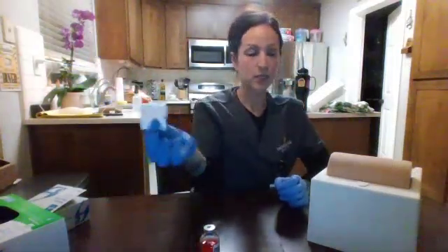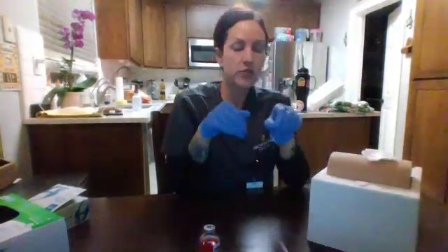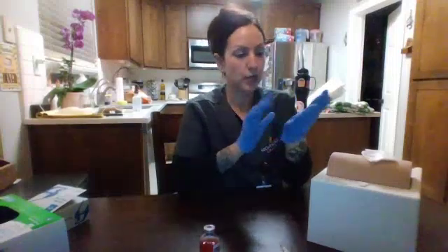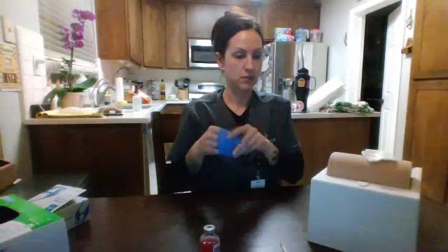I'm going to place a gauze pad over the injection site. I'm not going to press or massage on the area. There might be some bleeding. It is a blood thinner. I'm going to remove my gloves. And I'm going to perform hand hygiene. Now I'm going to document that I just administered this medication to the patient.